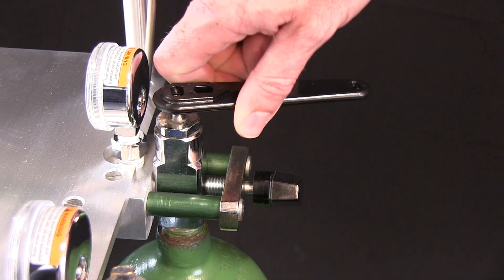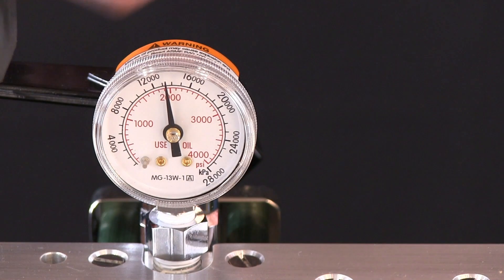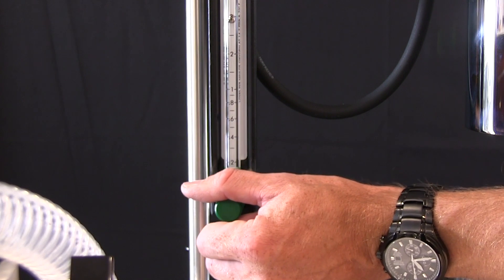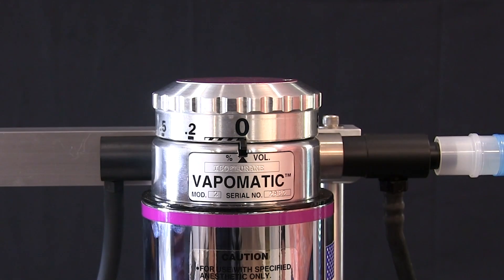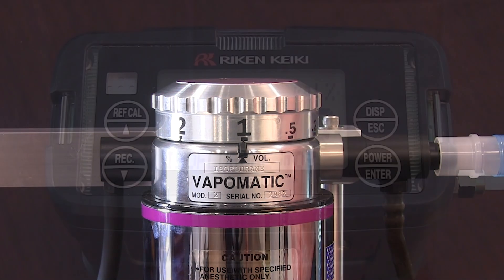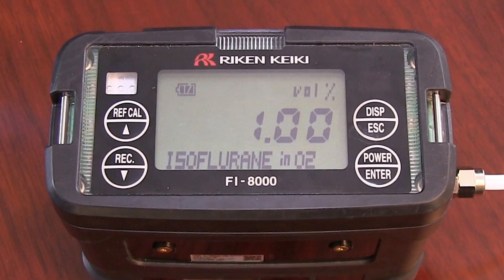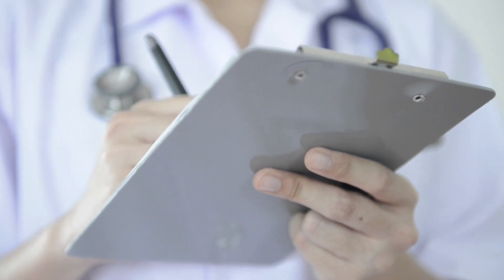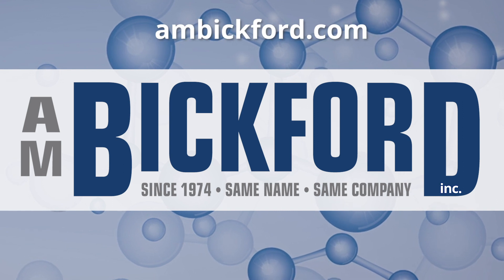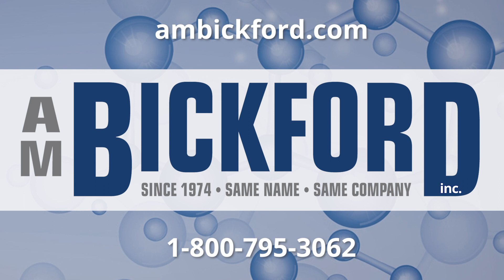Turn on the carrier gas source to enter the anesthesia machine. For this demonstration, we are using oxygen as the carrier gas. Turn on and set the flow meter to the vaporizer manufacturer's suggested flow in liters per minute, as it can differ by company. For this demonstration, we will set the flow meter at 3 liters per minute. Turn the vaporizer's dial to 1%, let the reading stabilize, and verify the anesthetic output on the FI-8000P. Make sure to record the readings. For more information, please visit our website at ambickford.com or call us at 1-800-795-3062.